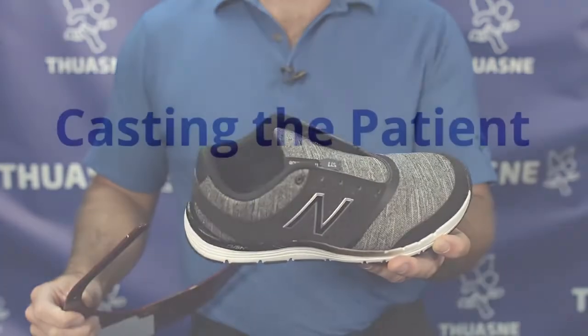the proper footplate size. When casting for a custom AFO, Townsend Design wants to make it perfectly clear that it is very important to use a footplate. Now, without the footplate, everything would be relatively flat, and that would negatively impact how the brace fits within the shoe. To avoid that, utilize a footplate, whether it's something that you purchase or something that you make in-house.